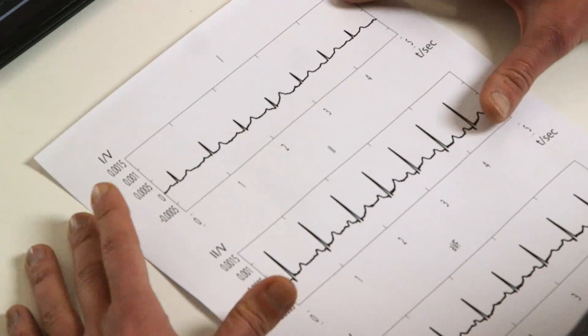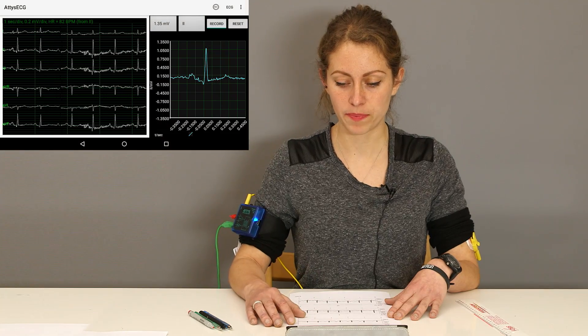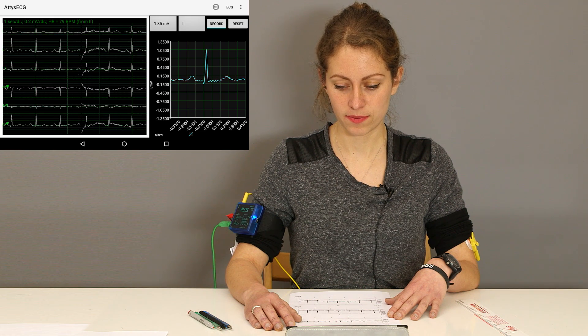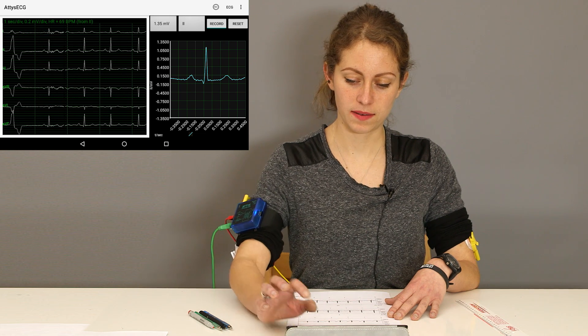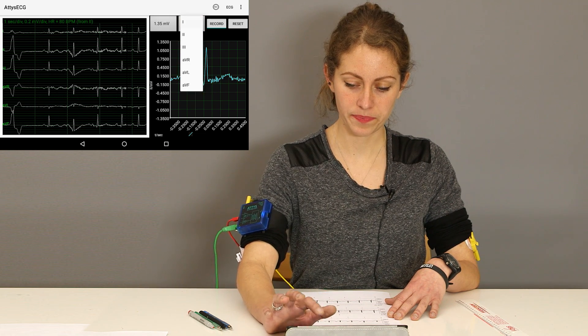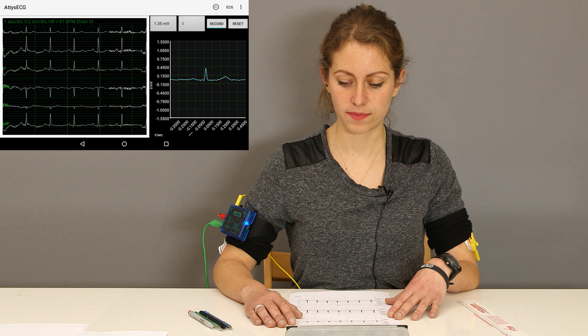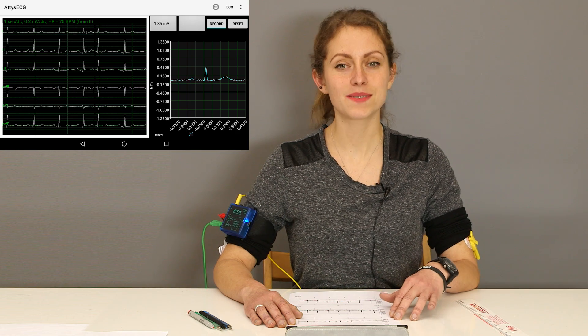Here is a printout of my ECG which you can also see running in the background. Here we have Eindhoven 2 and Eindhoven 1. There it is, nice and clear.